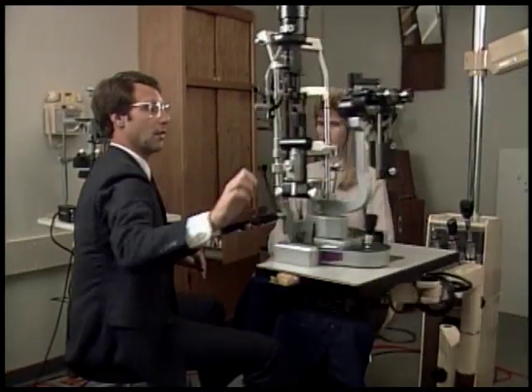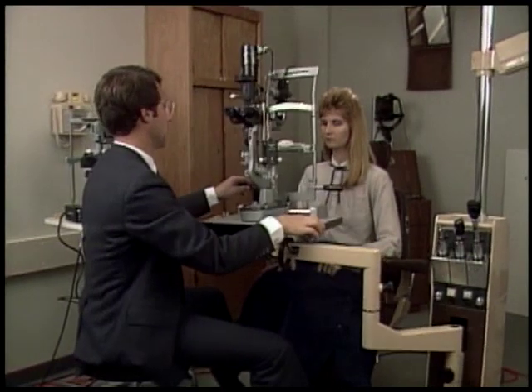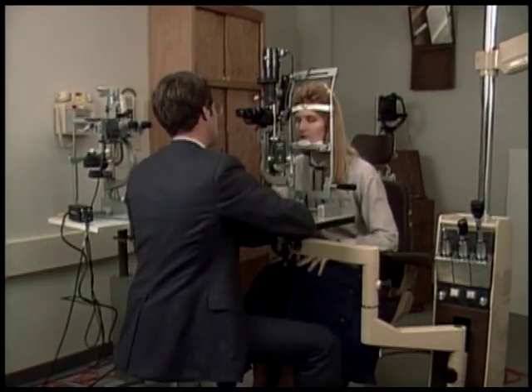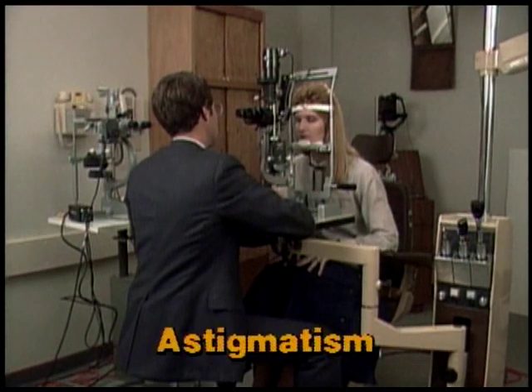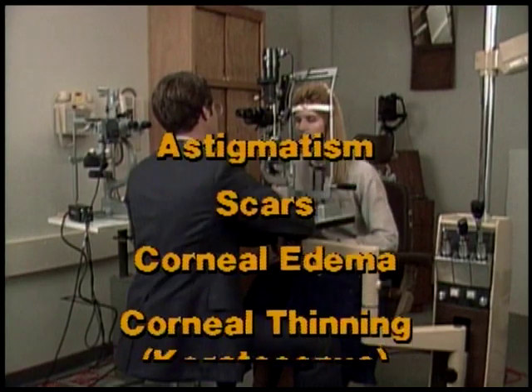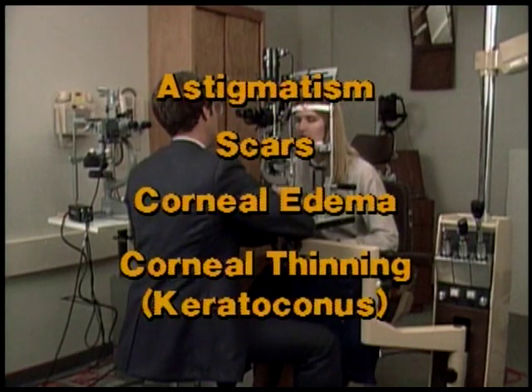Although Goldmann Applanation Tonometry is widely accepted and shown to be highly reliable, it is not without problems. Some of the difficulties are encountered in patients with surface changes on the cornea, including astigmatism, scars, corneal edema, and corneal thinning, or keratoconus.